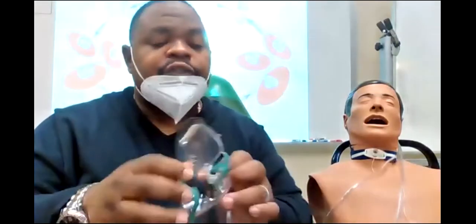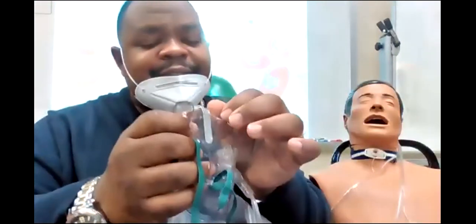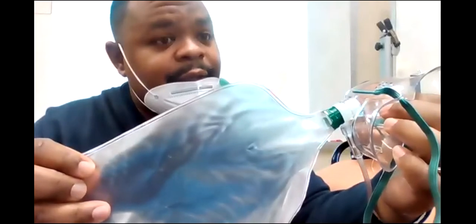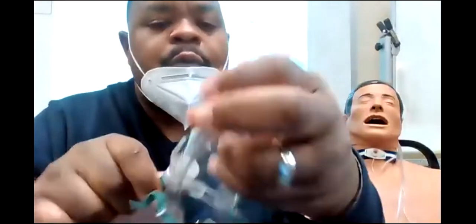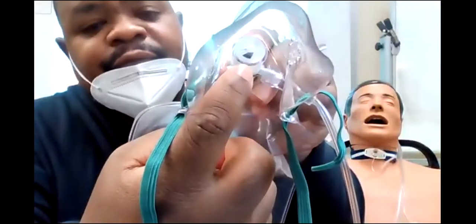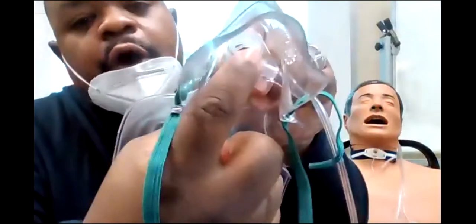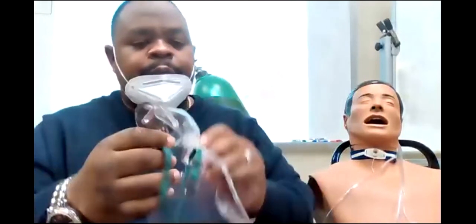This is a partial rebreather mask. It has a small bore tubing connected to a mask, right? With exhalation ports. And a reservoir bag, okay? This is a reservoir bag here. It also has no valve between the bag and the mask. See that? That's wide open. That's just a little gate there, but that's not a valve, okay? Between the mask and the bag, there is no valve, no flappy like a heart valve. There's no valve there, okay?